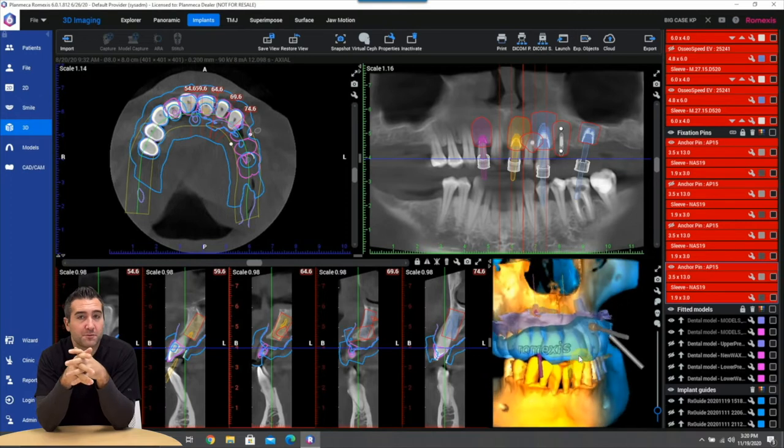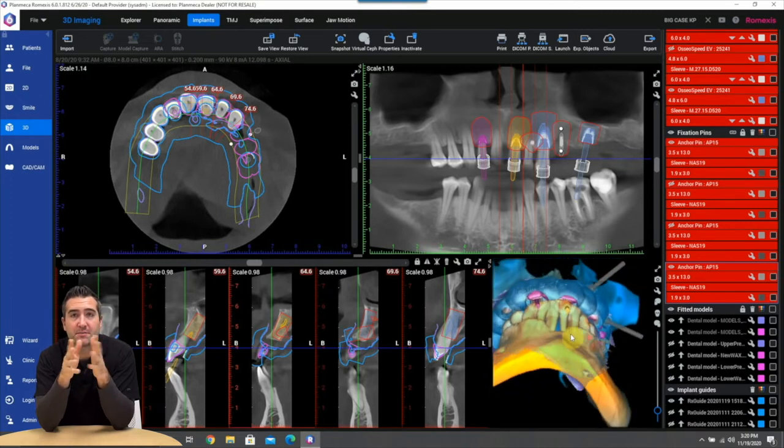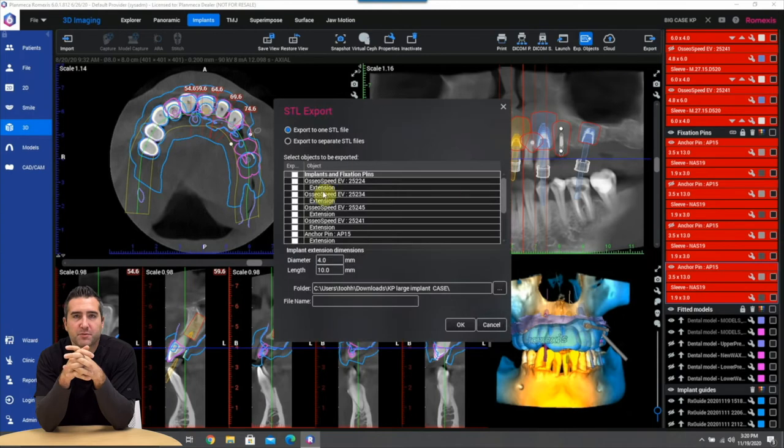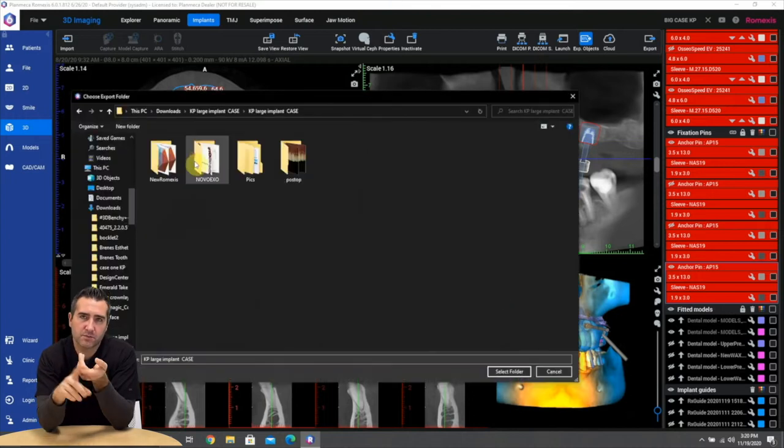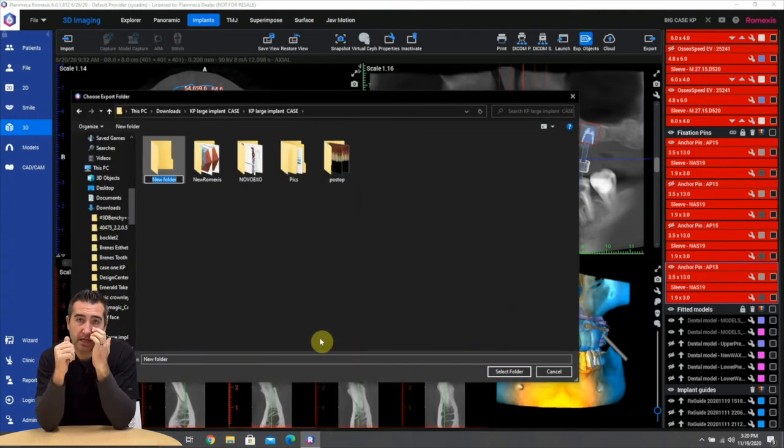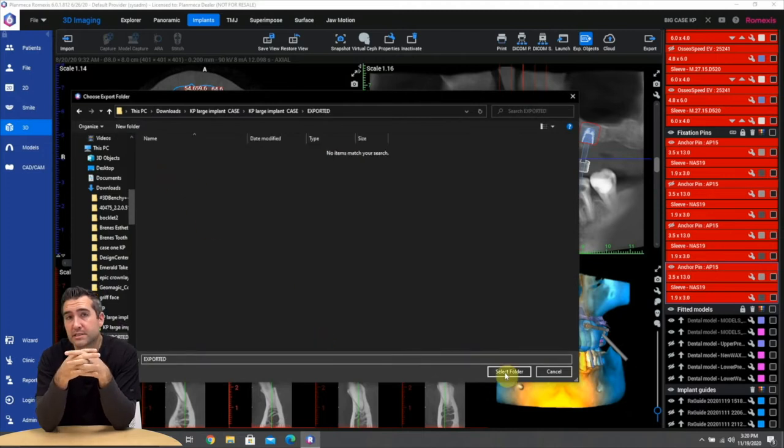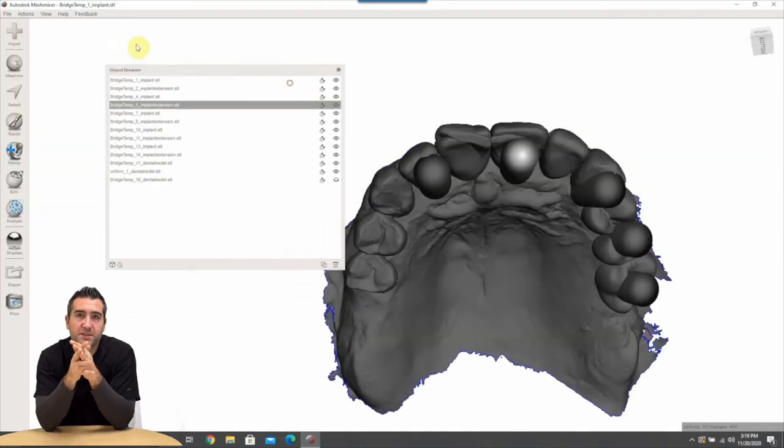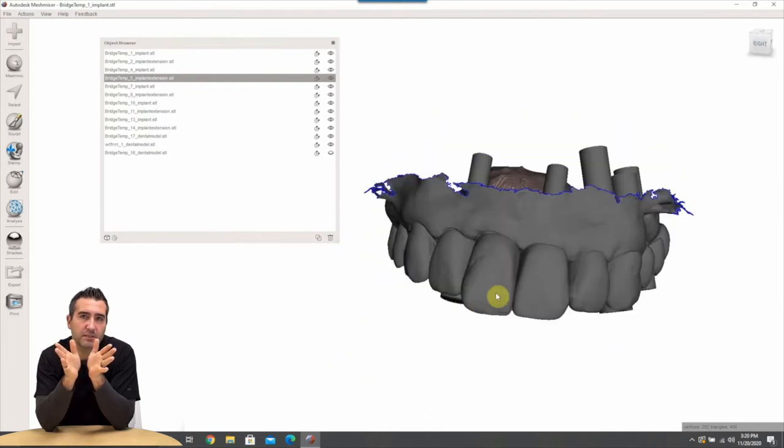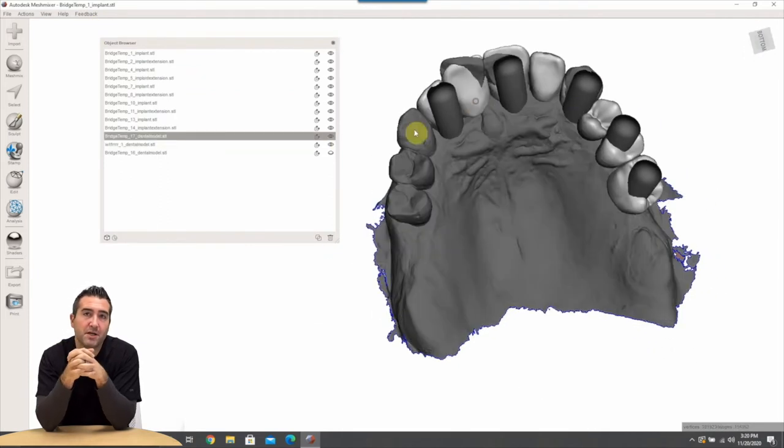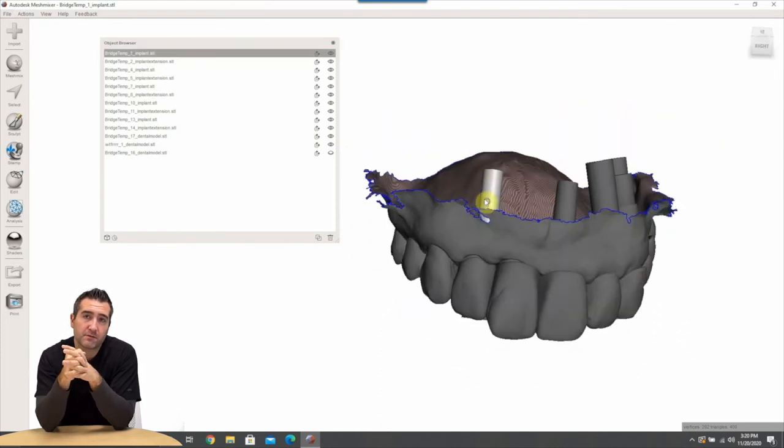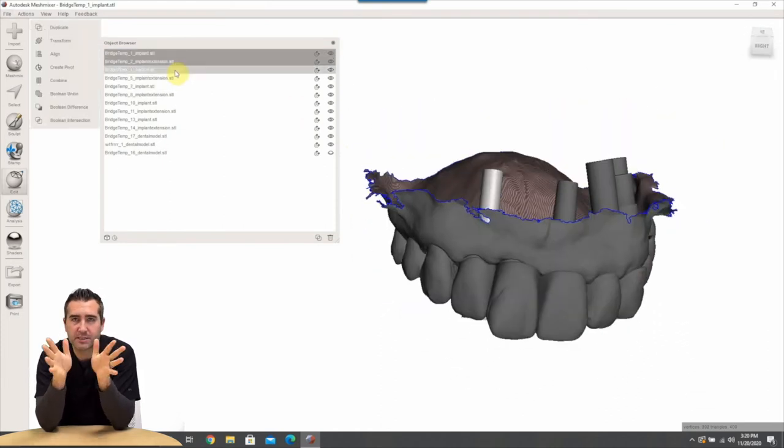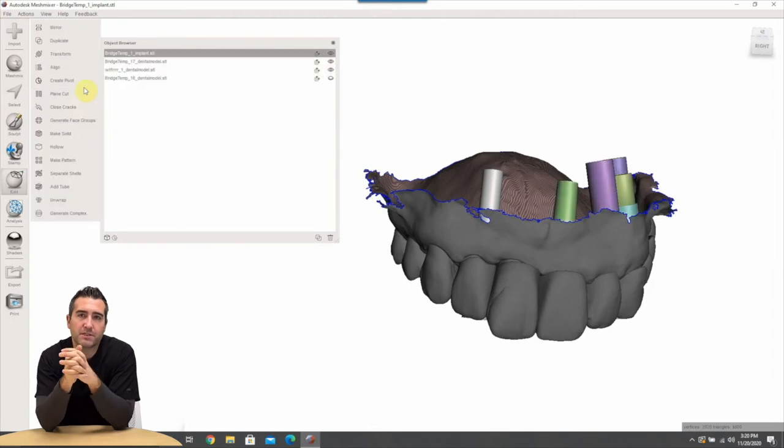With Romexis what we're going to do is we're just going to go up to export and we're going to export everything: the guide, the fitted models, the wax up, the extension tubes, the implant locations. Everything's going to pop out as separate and distinct STL files. And from this information the sky's the limit. In this particular instance we're going to put it into Meshmixer which is a free software, probably one of my favorite softwares ever. You could put this into back in PlanCAD Premium, you can put it in a 3Shape, essentially your laboratory.